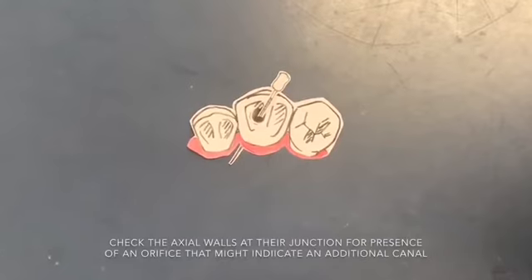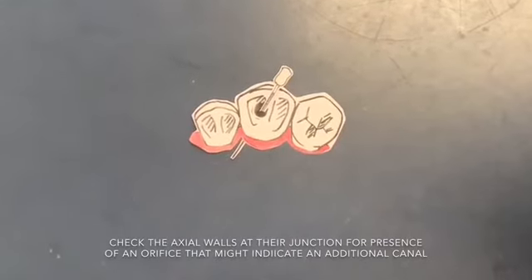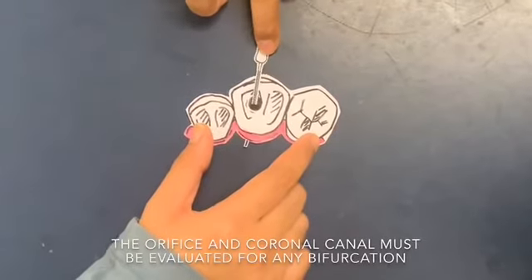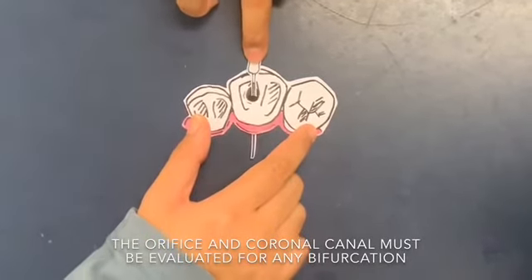Check the axial walls at the junction for presence of an orifice that might indicate an additional canal. The orifice and coronal canal must be evaluated for any bifurcation.